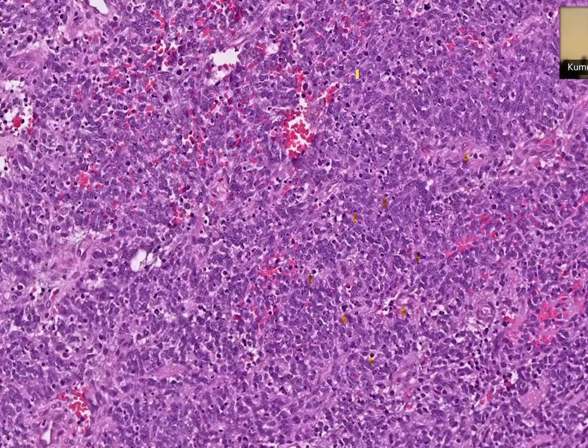So you have a packed cellular tumor. Cells, maybe you can't say small, you can say small to intermediate, more or less of similar size all throughout, and it has a very high apoptotic index. It tells you it is a very rapidly, highly proliferating tumor. So what is your impression? You can see this.